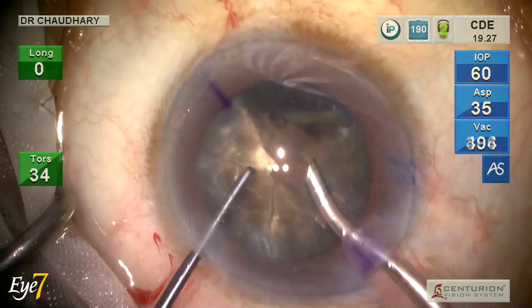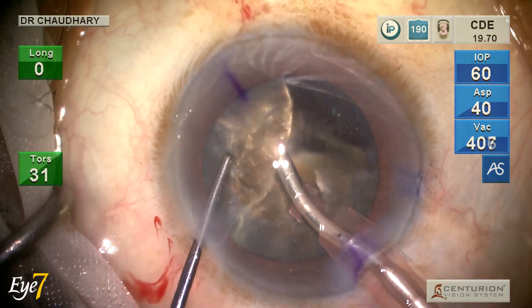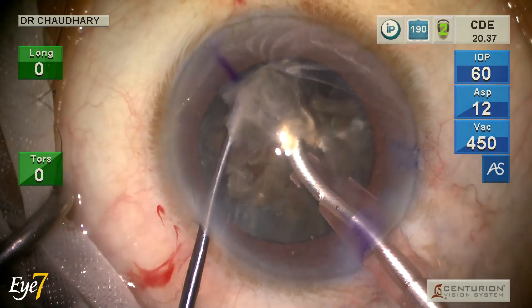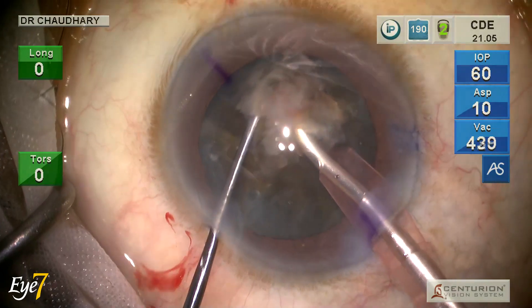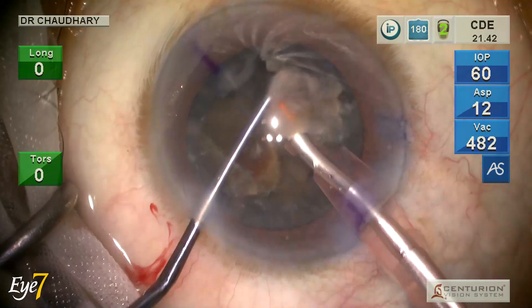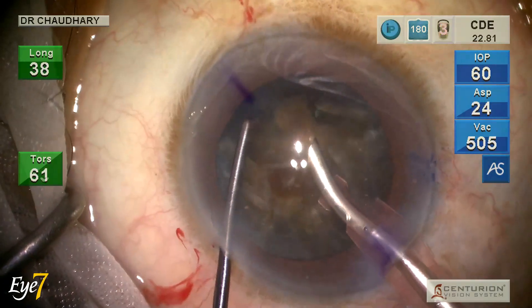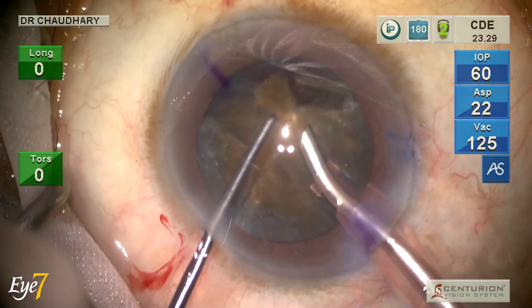Torsional phaco works like magic. You can see how this hard nucleus is getting emulsified with the side-to-side movement of the phaco tip, specially enhanced by the balanced tip which gives a very high amplitude of torsional movement. Very good emulsification of the hard nuclear pieces — I am showing each piece removal step by step so you can follow as I emulsify each one.